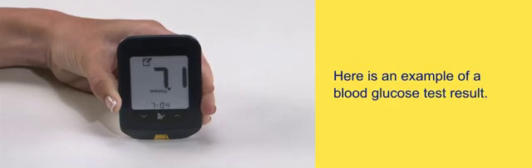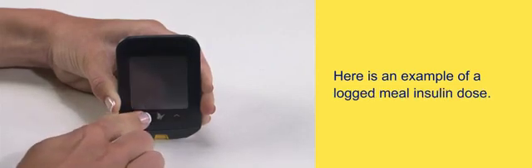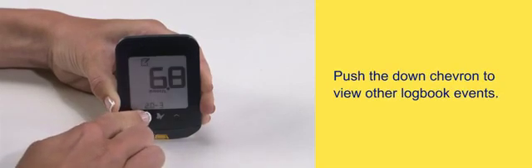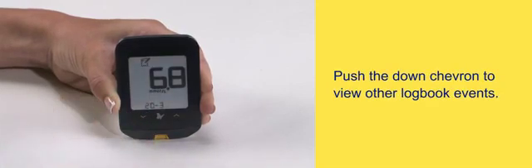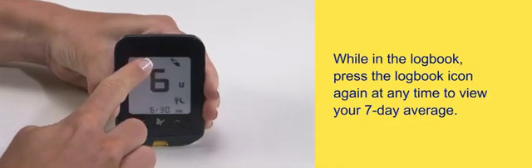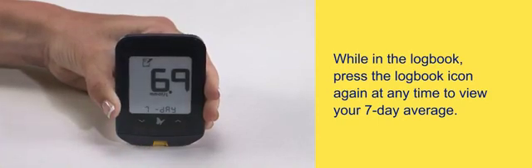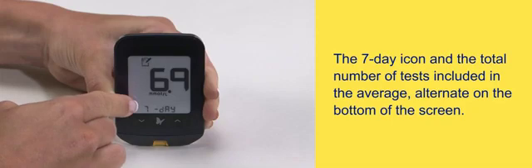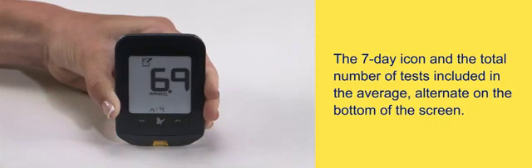Here is an example of a blood glucose test result. Here is an example of a logged meal insulin dose. Push the down chevron to view other logbook events. While in the logbook, press the logbook icon again at any time to view your seven-day average. The seven-day icon and the total number of tests included in the average alternate on the bottom of the screen.